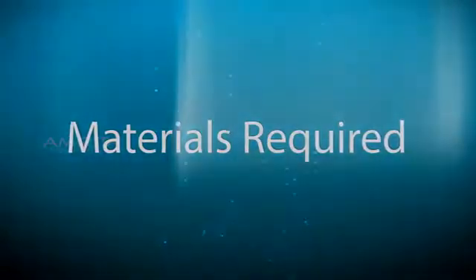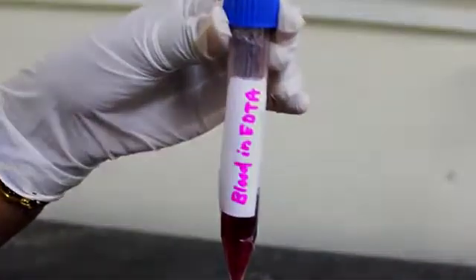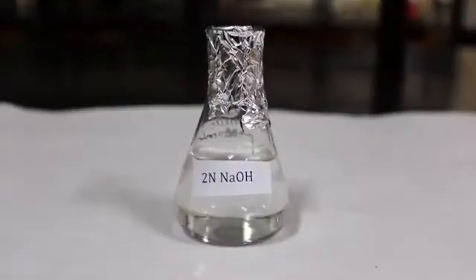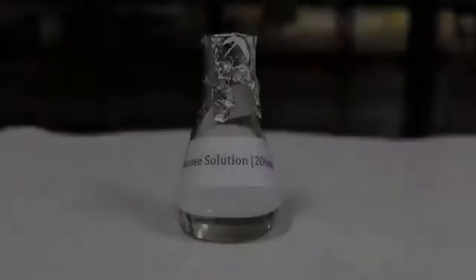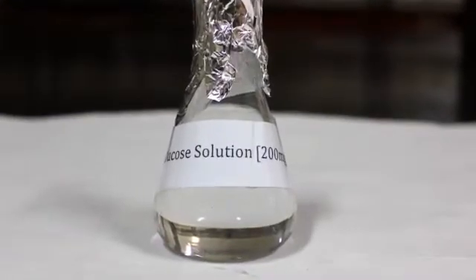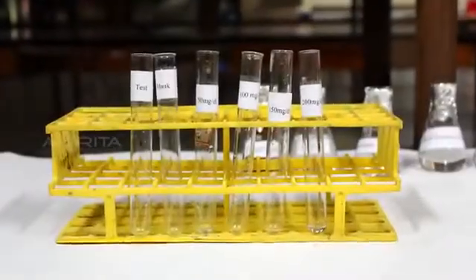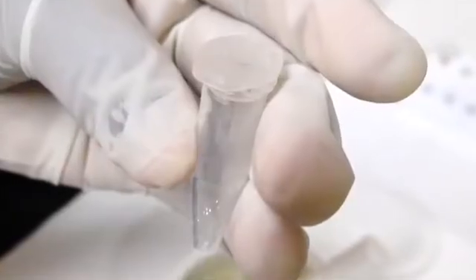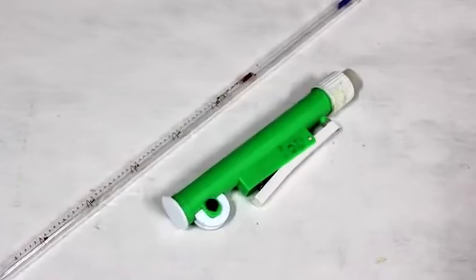Materials required: blood sample collected in an EDTA bottle, glucose oxidase reagent, 2 normal sodium hydroxide, sodium sulfate zinc sulfate reagent, 200 mg/dL of standard glucose solution, distilled water, test tubes, micropipettes, Eppendorf tube, 5 ml glass pipette and pipette pump.